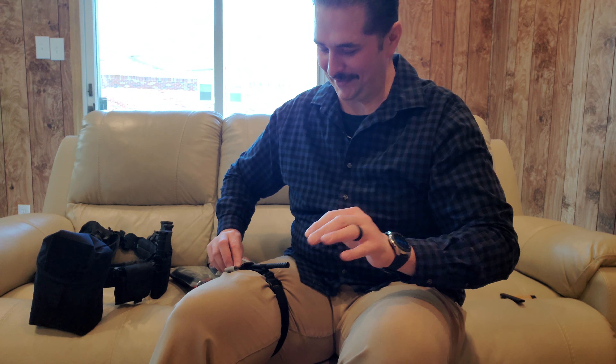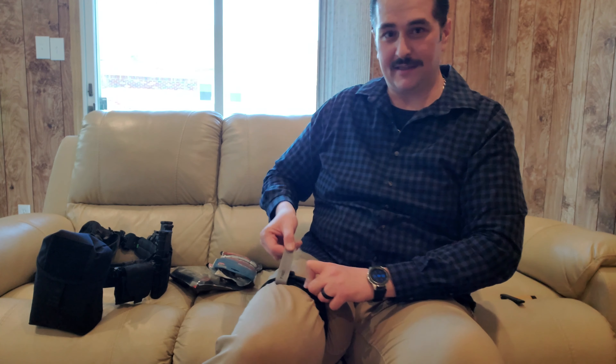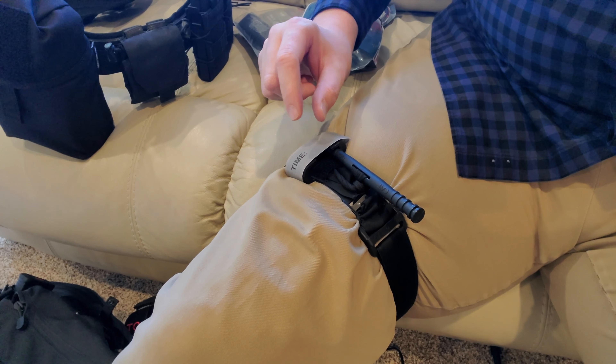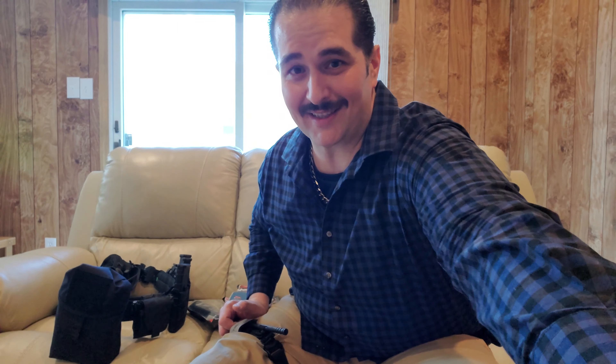You put it through your leg or your arm or wherever you need it, then you take that red tab and close it — get it real tight. Then you have this windlass right here, and you turn it, give it as many turns as you need. You stop when the bleeding stops — that's when you know to stop turning it.